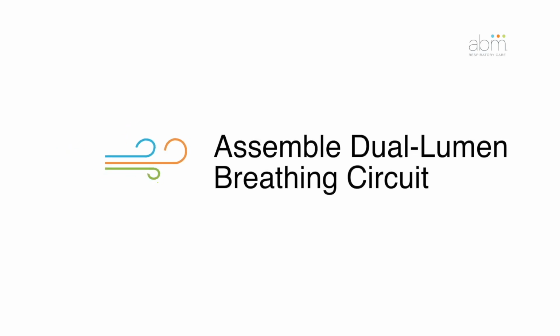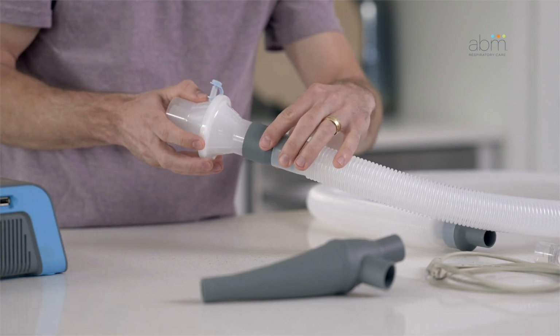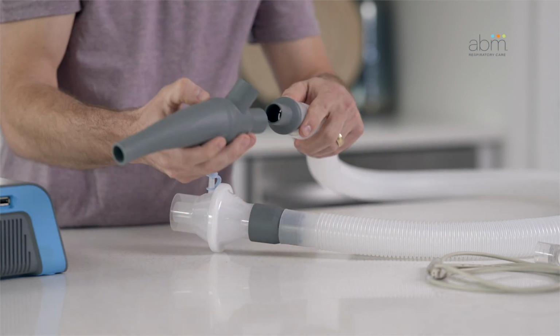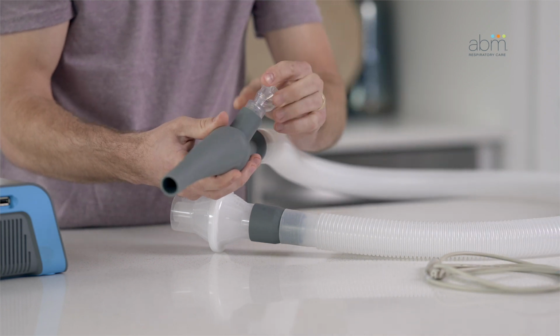Assemble dual lumen breathing circuit. To assemble the patient circuit, attach the larger end of the coaxial tube to the end of the bacterial viral filter that has the company logo. Connect and twist the handset into the smaller end of the coaxial tube. Insert the Aerogen nebulizer to the top of the handset.